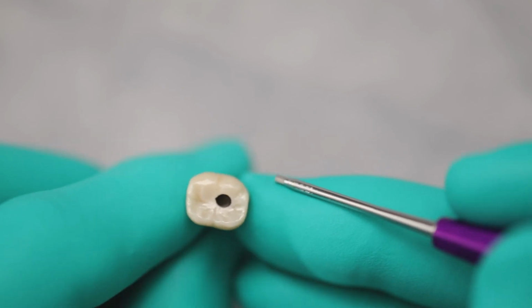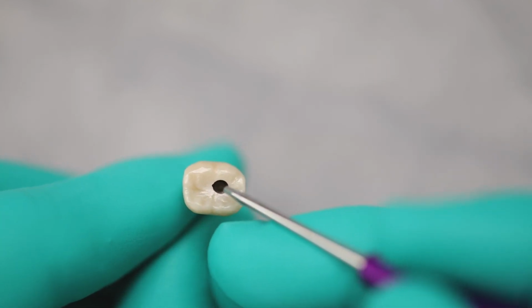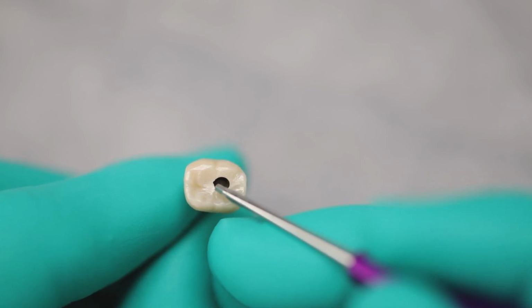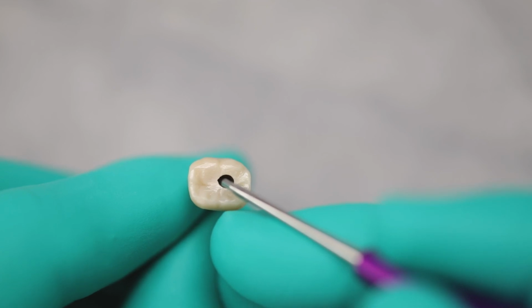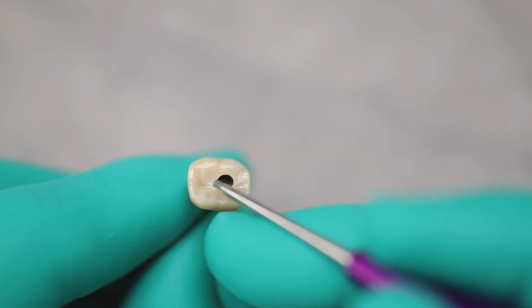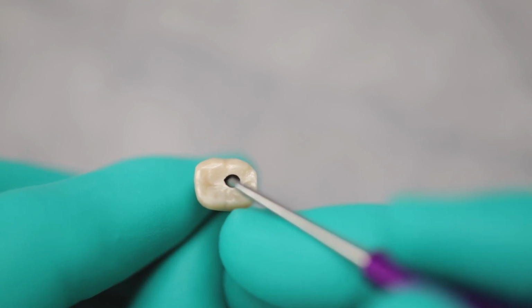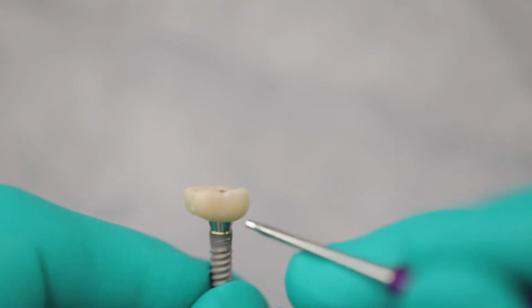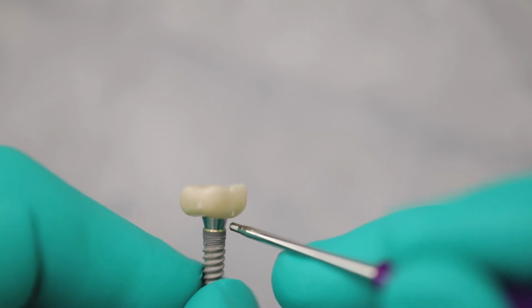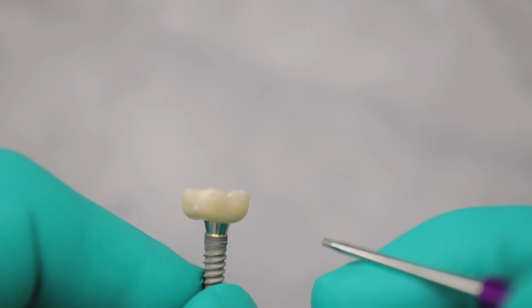You can see from this access hole that the clinician got the implant in the buccal-lingual dimension really nicely, but was a little bit off in terms of the mesiodistal. So we'd like to see this access hole a little bit more into the middle here, and maybe just a touch more towards this side right here. If we did that a little forward and a little back, and that access hole was in the center, and then we went with a little bit bigger implant, and we had the proper emergence profile, you'd likely hold this solution for a very, very long time.